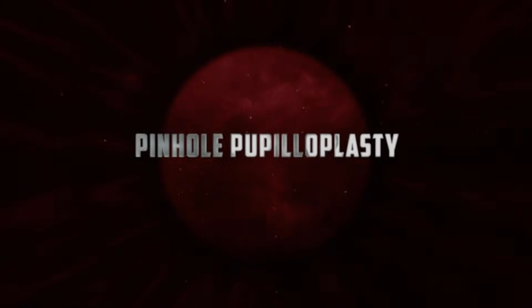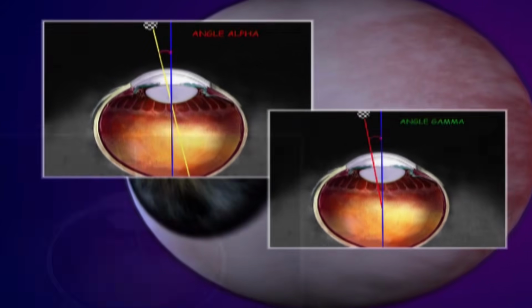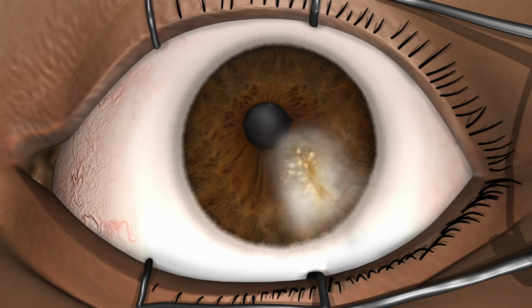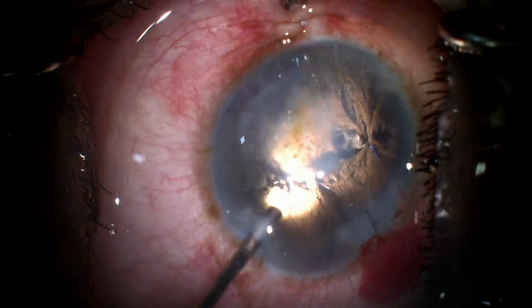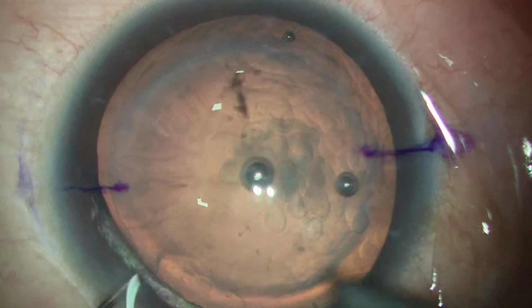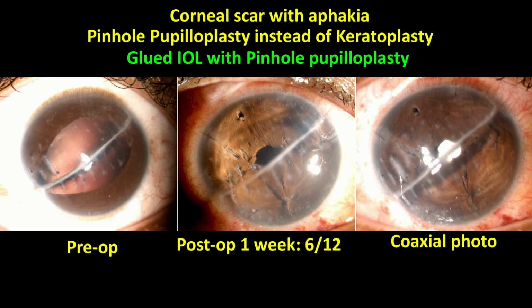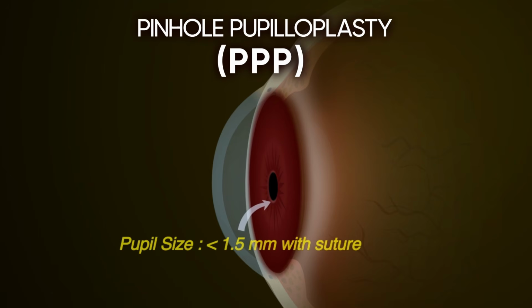Pinhole pupilloplasty. Pinhole pupilloplasty represents a fundamental shift in the approach to pupil restoration. In many complex cases, especially those with corneal scars or irregular optics, the limitation is not the iris structure but the compromised optical system. Historically, these cases were managed with keratoplasty. However, global donor shortages leave millions waiting, making alternative optical solutions essential. The pinhole pupilloplasty offers such a solution.